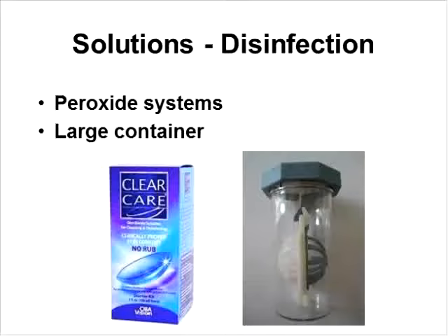It just means that you've got significant alignment, and you want to assess how much suction you have when the lens comes out. If there's suction, you're too tight. But oftentimes, if the lens comes out easily, it's okay, and that will reduce the amount of debris. That's a big problem. So you don't have to have fluorescein exchange to have the perfect fit. You just have to make sure you don't have suction.